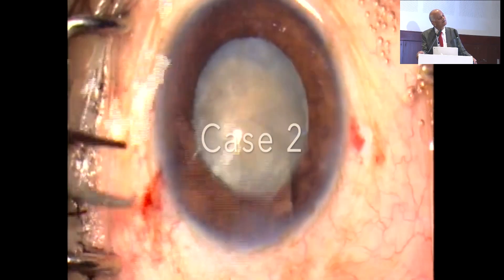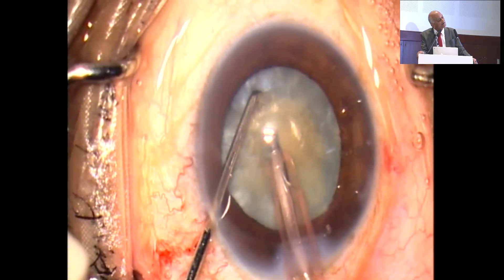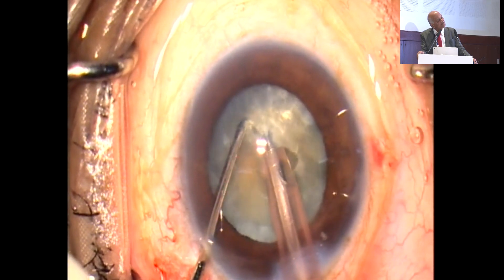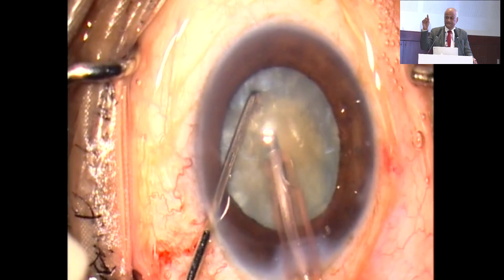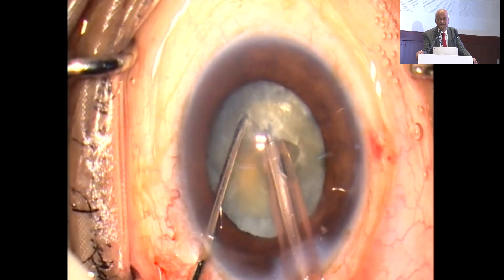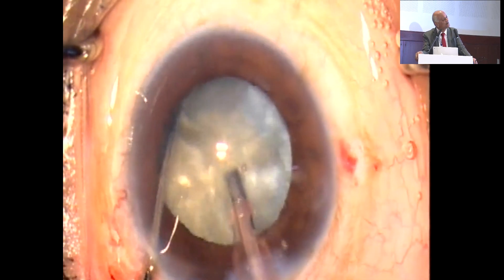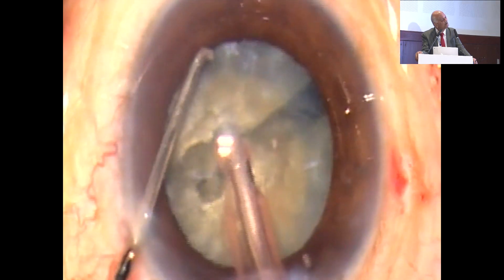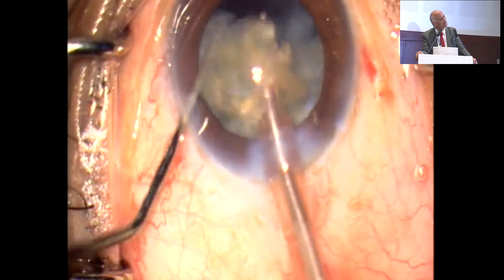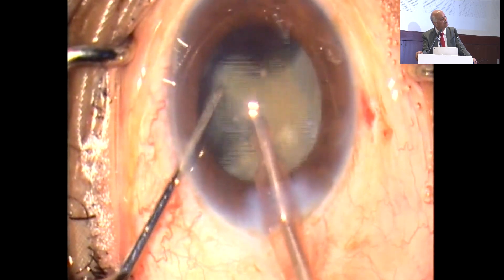Here you can see another type of cataract, and see how I am doing this — the tip is buried inside. Once I bury inside, you can see my tip of the chopper, and the separation is possible. Your tip should go down slightly — if it is parallel and horizontal, it slips. So the movement of the tip should be slightly downward. Whenever you are putting the chopper, the movement is going down so it goes into the substance, and then the chopper should be not in the same line — slightly on one side — so that space is there, and by that space we can remove the cataract.